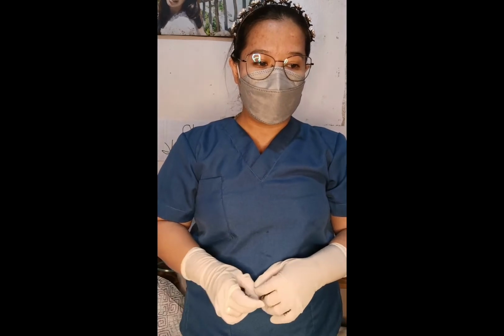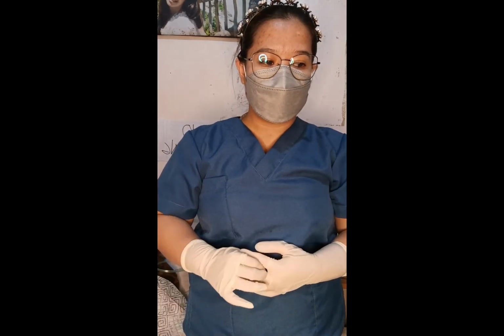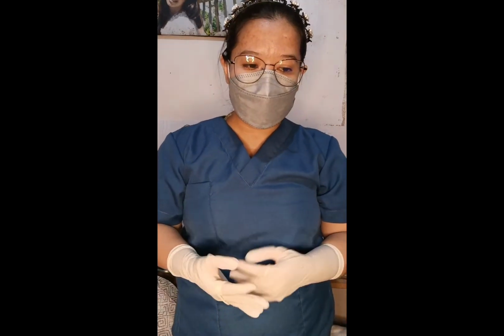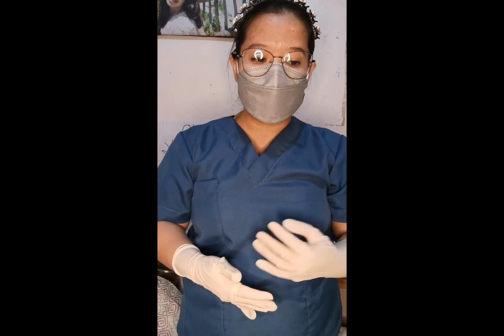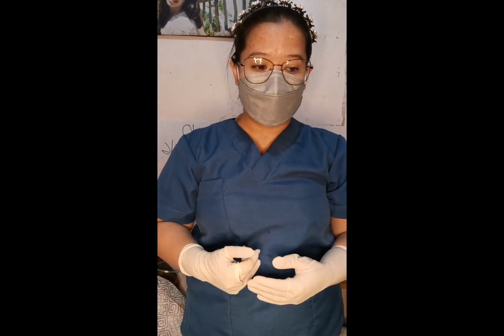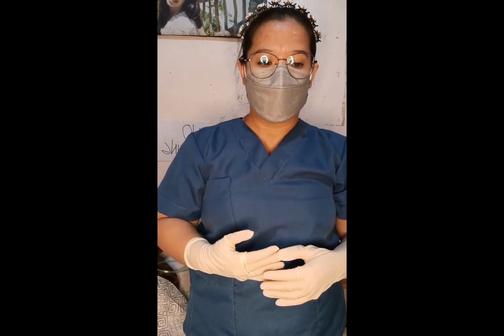Please note that the cannula permits one freedom of movement and does not interfere with the client's ability to eat and talk. If the prong is dislodged from the nares, replace it promptly. This is to ensure that the oxygen is delivered and to prevent hypoxia.